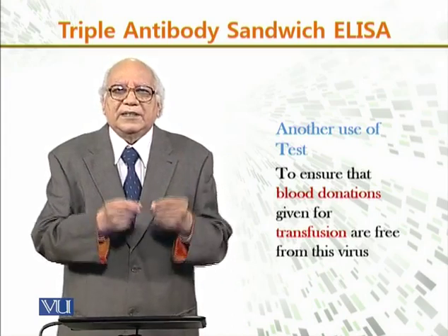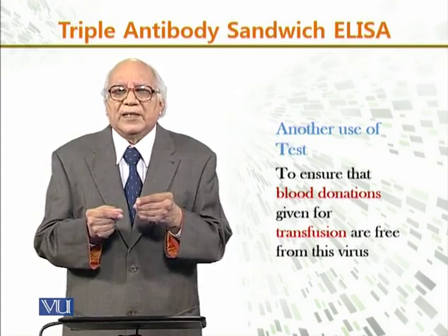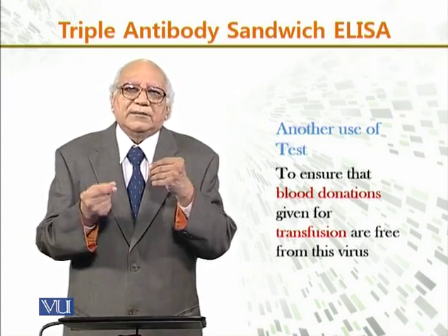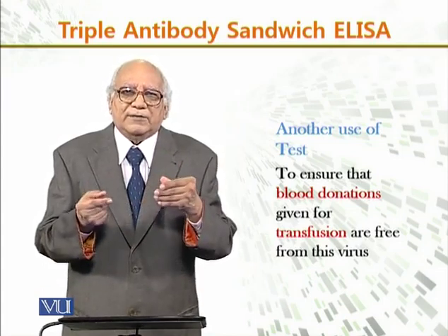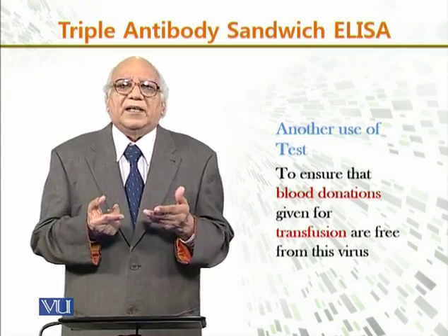It does not take much time to prepare the serum, and if it gives a reaction, then we can determine whether it is HBV positive or not.